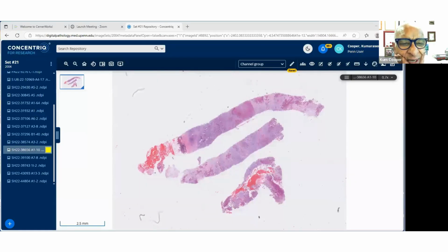Osteonecrosis would be a thought, particularly on low power, but the bone here was viable. There is a diagnosis here from Florence Norris, who's from Botswana. Nice diagnosis, Florence. Paget's disease.